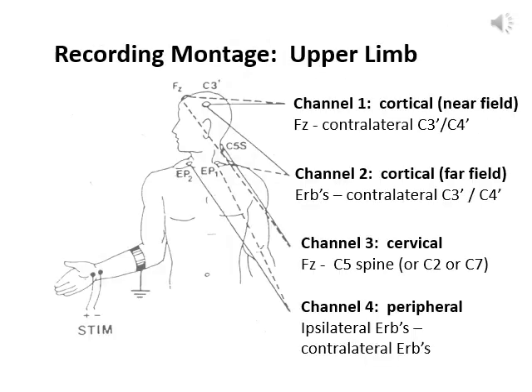For the upper limb recording montage, I will show you first the montages contained in the guidelines, and then we'll talk about what we do at Sick Kids. The upper limb SEP recording montage consists of 4 channels.